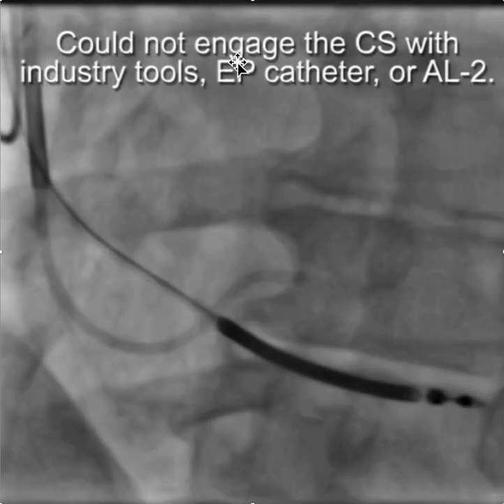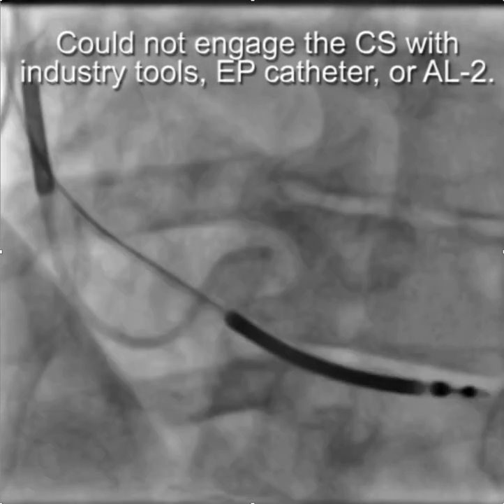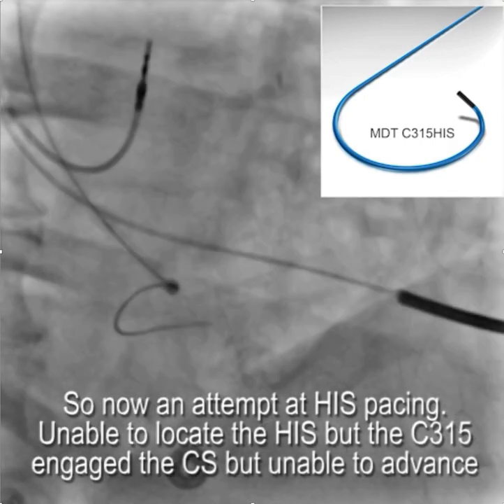He tried but could not engage the CS with the usual industry tools — an EP catheter or an AL2. So like a lot of people he thought maybe His pacing might be the answer, and he got out the C315 hiss, and rather than locating the hiss, he managed to get into the coronary sinus.